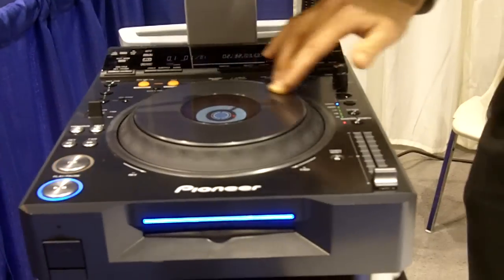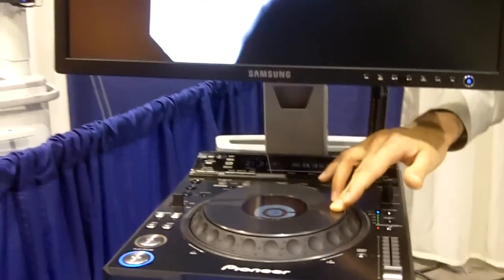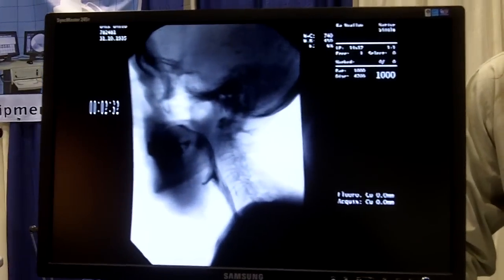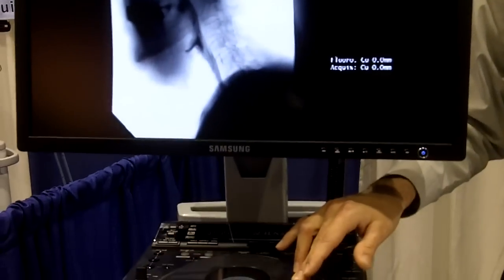What we have here is a swallow study, a barium swallow. We're also using it in endoscopy and a few other applications in the hospital where the hospital may not have the means or be interested in a large computerized system to be able to review video on an enterprise-wide solution.